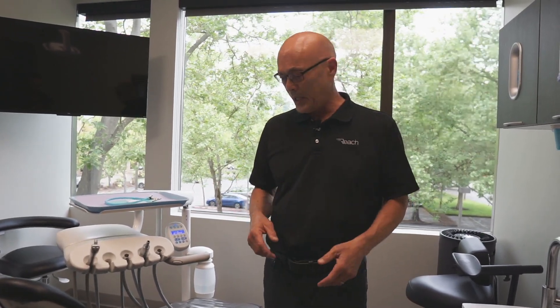Hello, welcome to Reach Tips. Today's topic is flushing water through your delivery unit. It's recommended that you do it once a day, preferably in the morning after it's sat overnight or over a long weekend.